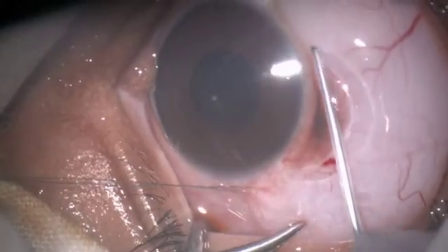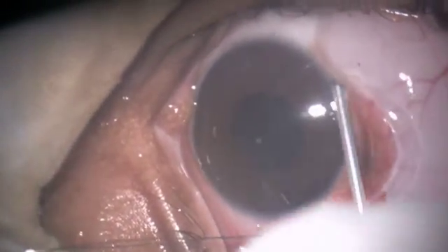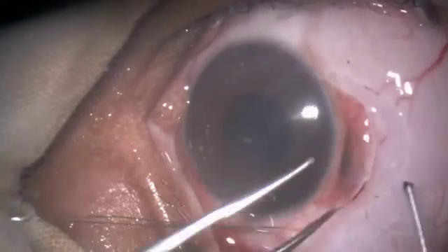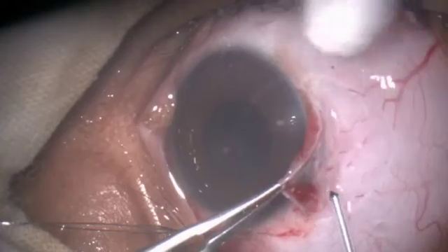Cutting the raised conjunctiva with Fugoblade 100 micron tip, then cutting the sub-conjunctival tenon capsule right up to the limbus.